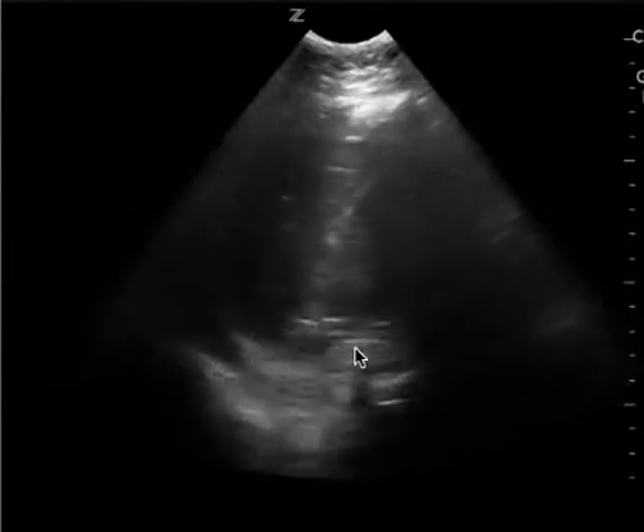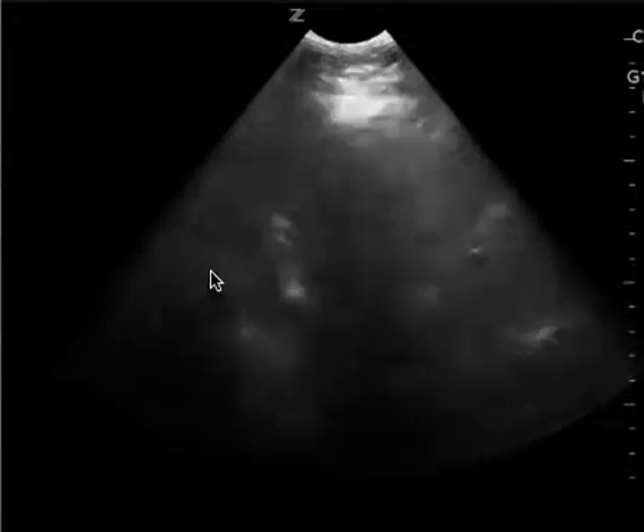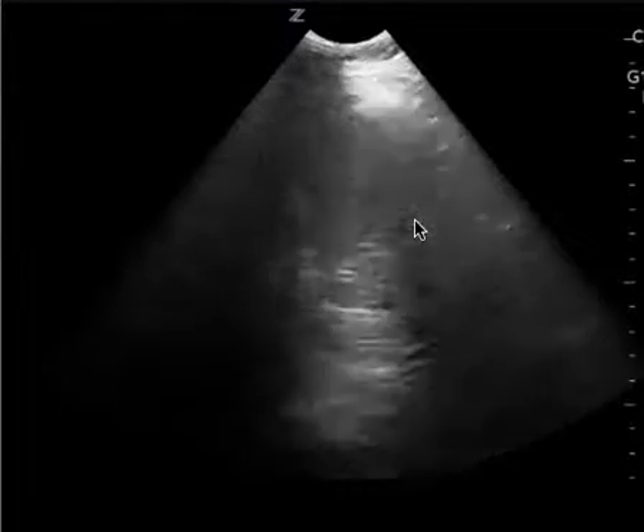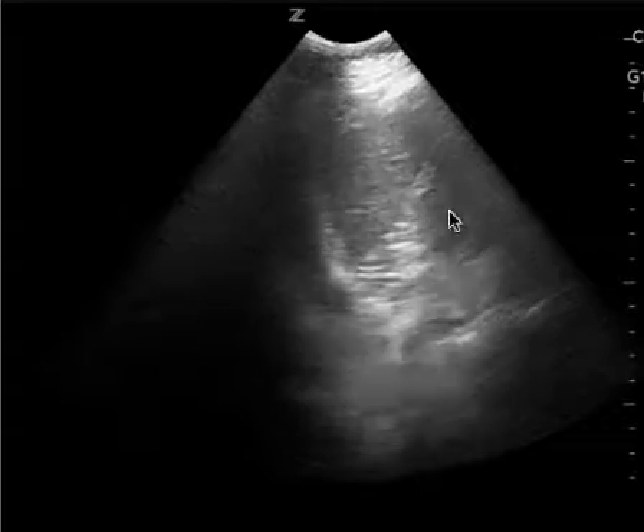This is an example of a different patient in the left upper quadrant. I can see the spleno-diaphragmatic space really well in this clip, and then the provider moves to get more of a splenorenal space that you can see over there in the beginning of the clip right here.